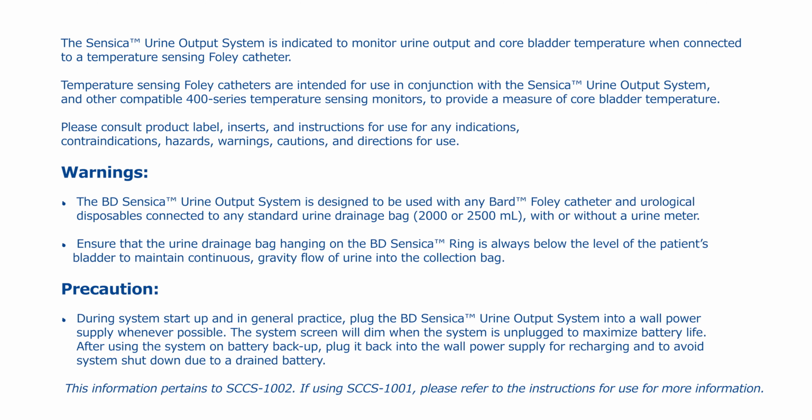This information pertains to SCCS 1002. If using SCCS 1001, please refer to the instructions for use for more information.